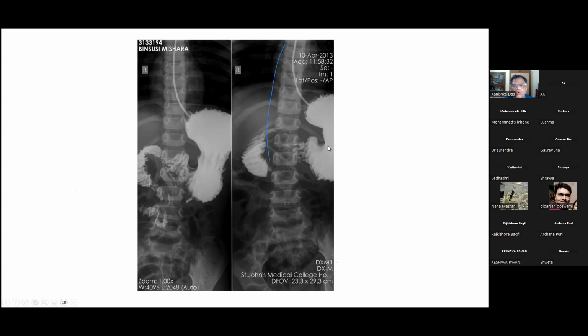So how do you go about doing the study in the radiology suite? You put in the contrast, you see it is not going, it is all there in the stomach, but you know that this should go, it's still not going. What do you do? You have done the study, right? Yes, sir. So tell me, how would you do it? You put enough into that NG. In fact, one of the reasons why we use that NG is so that you don't have to go on giving that fellow things to drink, and then he also finds it difficult. Correct. Yes, sir.